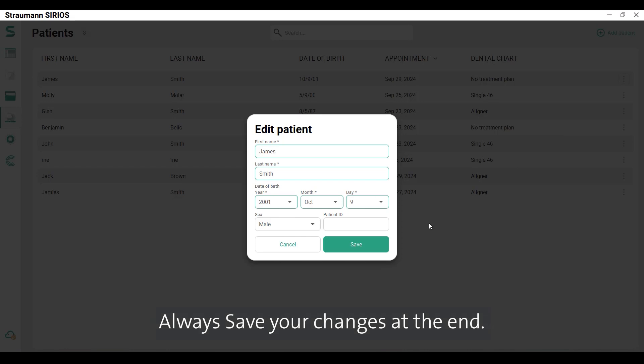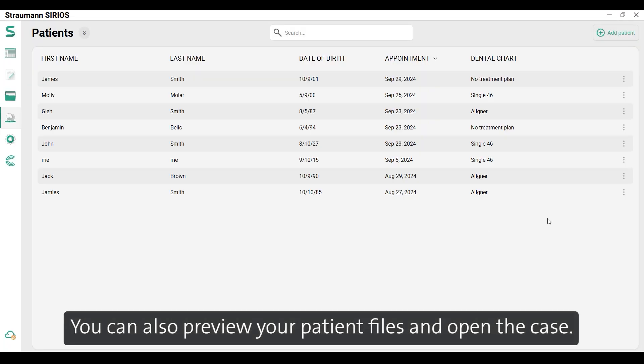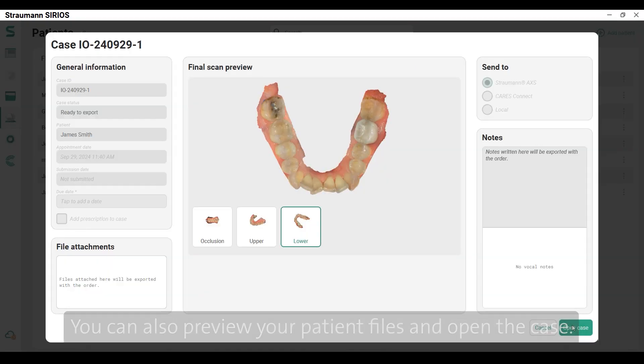Always save your changes at the end. You can also preview your patient files and open the case.